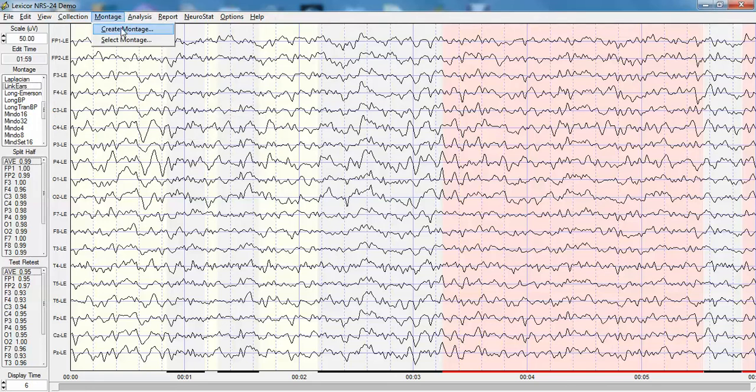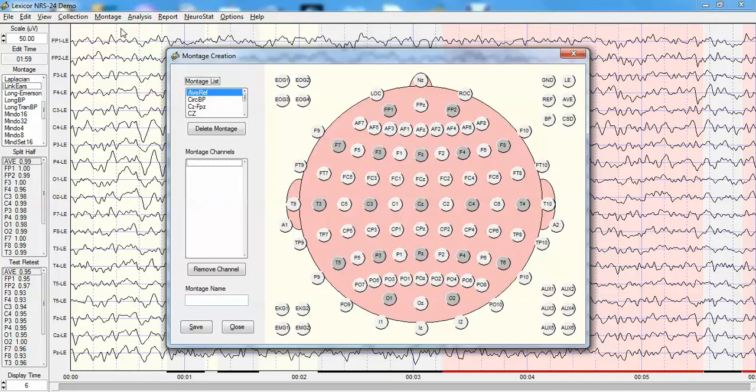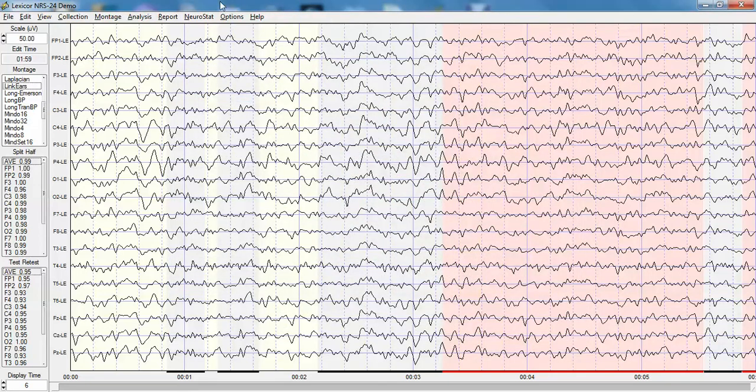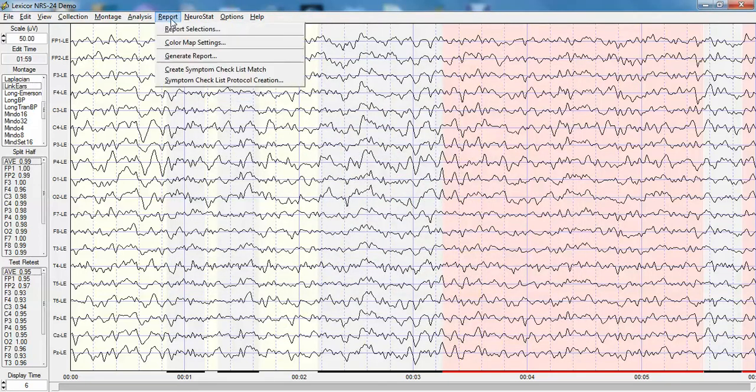One can create any montage one wants by opening up the montage window. There's 85 electrodes here, but NeuroGuide can import up to 128 channels. One can also generate reports.